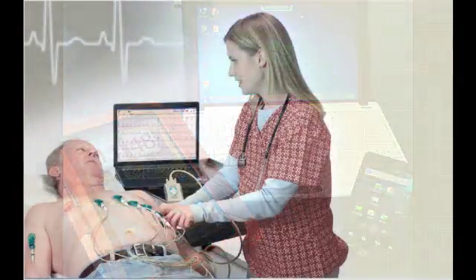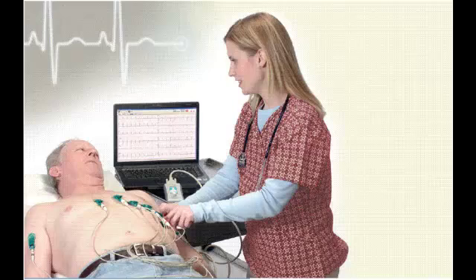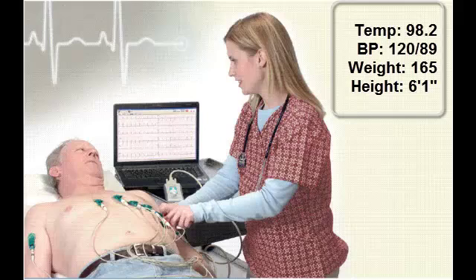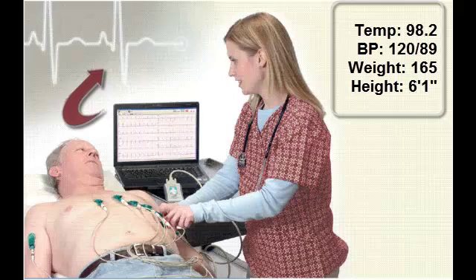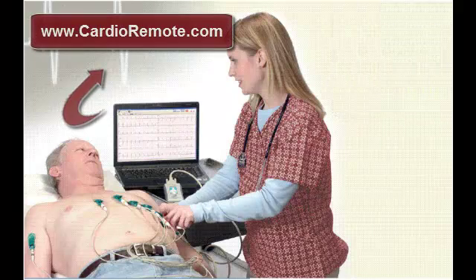When you walk into any doctor's office, the first thing they will do is to take your vitals. Cardio Remote allows them to capture and save this information from their phone, and at the same time it will be uploaded to their Cardio Remote user account on the web for review anytime and anywhere.